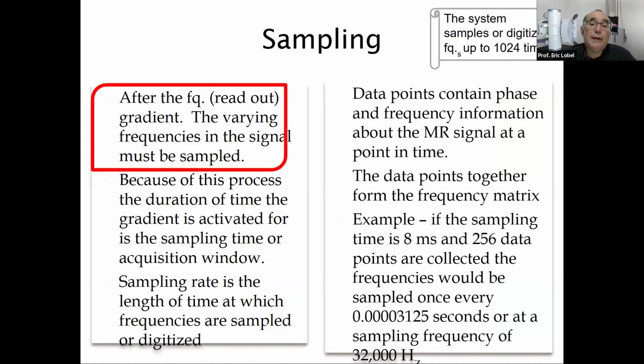When it comes to sampling, basically, I want you to think of Nyquist, right? So Nyquist is a sampling technique, right? When the echo is coming out of the patient, that's that moving magnetic field, and Faraday's law is at play again, which is going to then induce a current in a nearby coil. That information that we get, we're going to sample it and then digitize it.